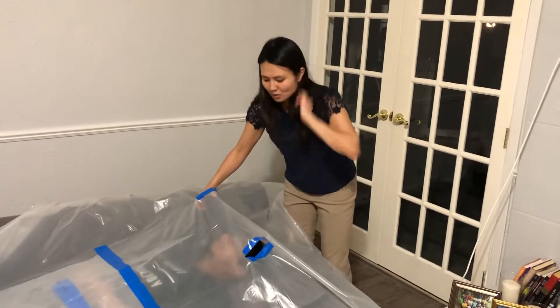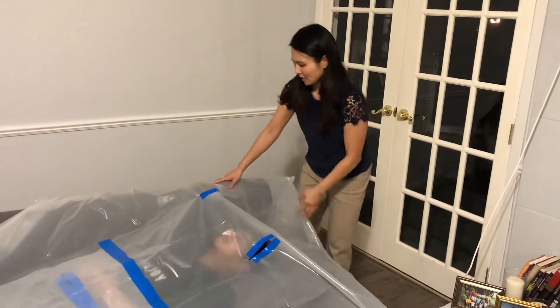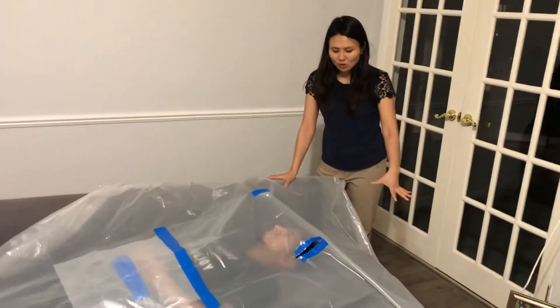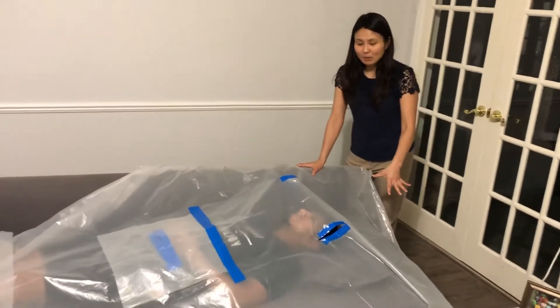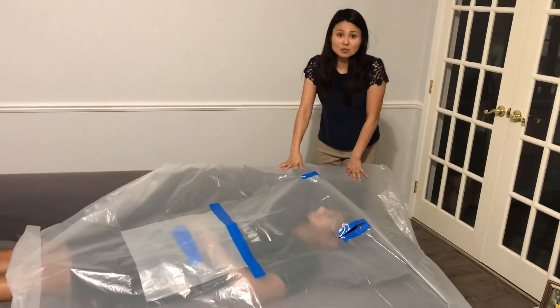A GlideScope is easier because then your camera's outside of the sheet if it's not completely transparent like ours is. I got the materials at Home Depot — a roll of 25 feet was about $15, and duct tape and scissors are the only other things you need.